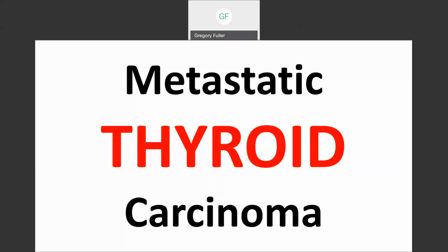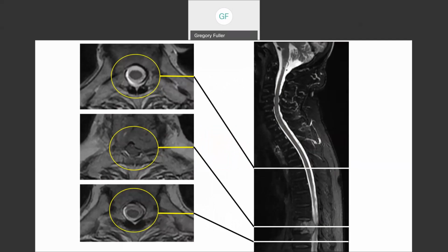Or what about patients who present with spine metastasis as the initial presentation? It is a significant percentage of patients, as we learned from Dr. Tatsui in his excellent clinical conference with his colleagues last week. This is the same case. Here we're looking at the metastasis in axial and sagittal sections, and you can see that I've drawn the cross-plane lines to show you approximately where the sections were taken.